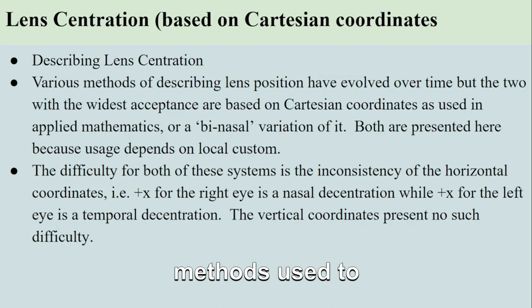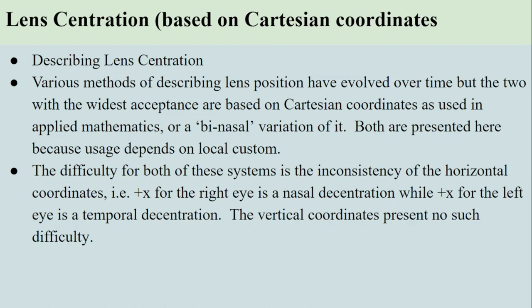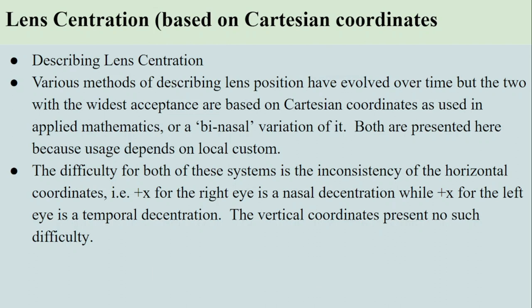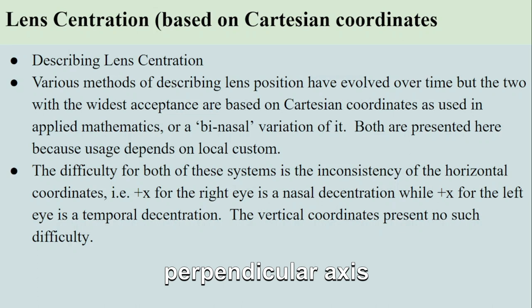There are various methods used to describe lens position, but we will focus on two widely accepted approaches: Cartesian coordinates and a variation known as bi-nasal. Let's start with Cartesian coordinates. You might be familiar with the Cartesian coordinate system from your math classes. It uses two perpendicular axes, usually labeled X and Y.